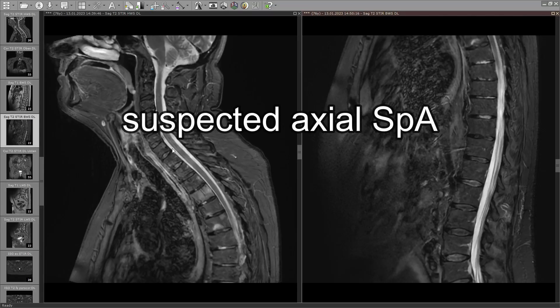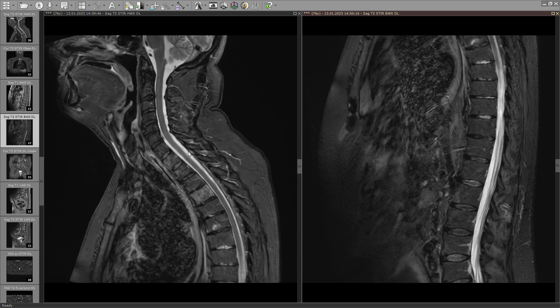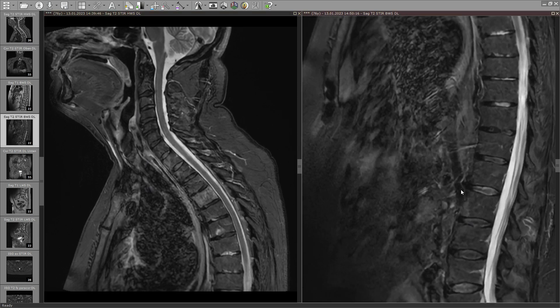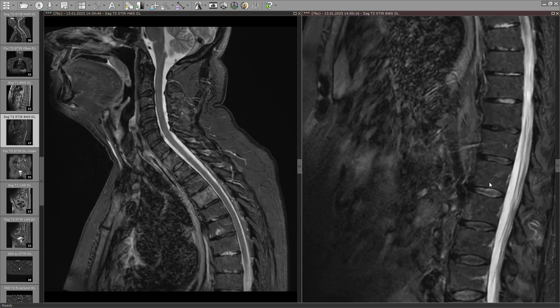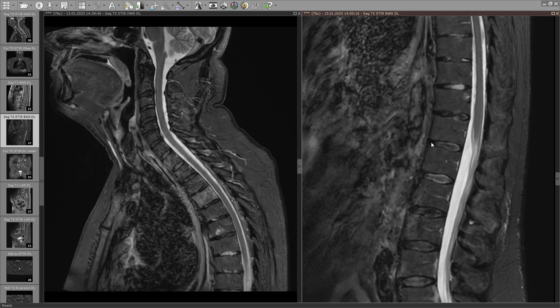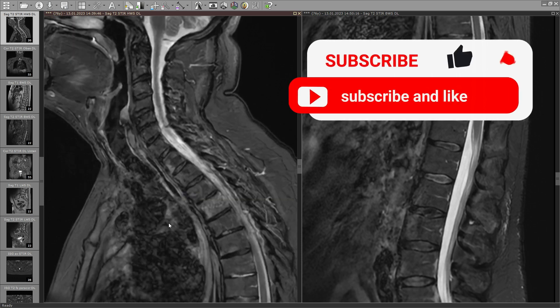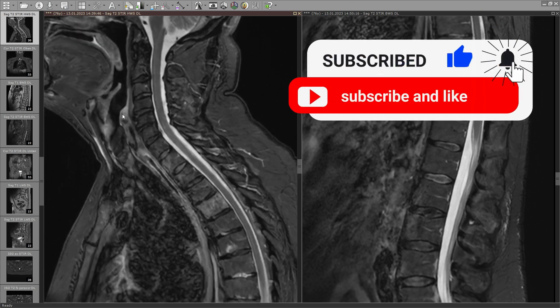This is a patient with a clinical suspicion of that disease and the MRI was done to see what's the actual burden of inflammatory disease. The problem is if you just scroll through quickly and try to find the typical findings that we all learn and know, like anterior spondylitis, focusing on the anterior corners of the vertebral bodies, there are some artifacts which might make things a little bit more difficult.